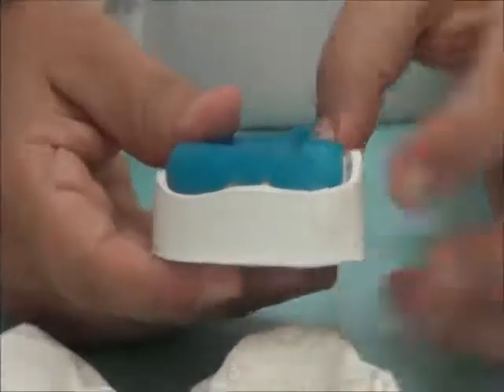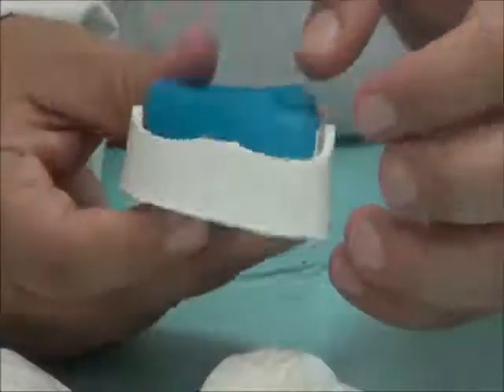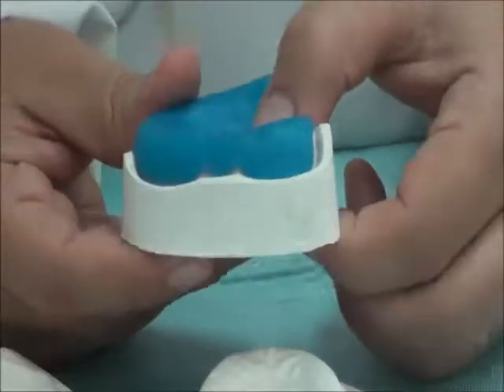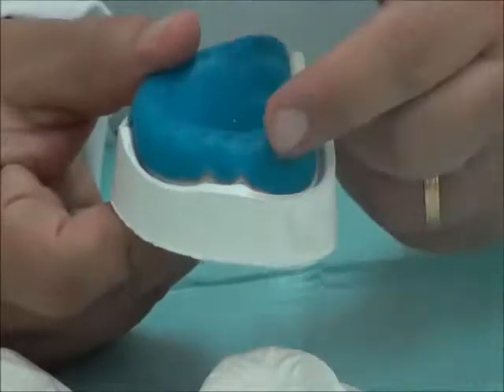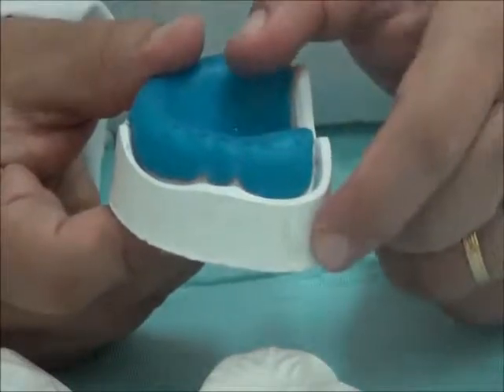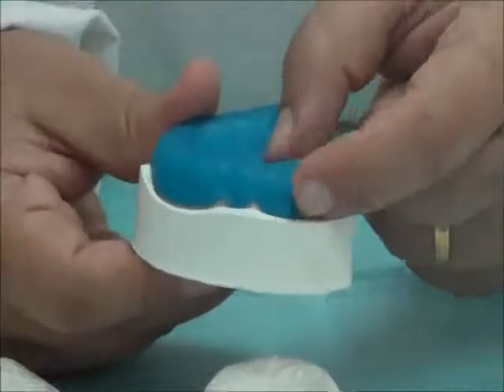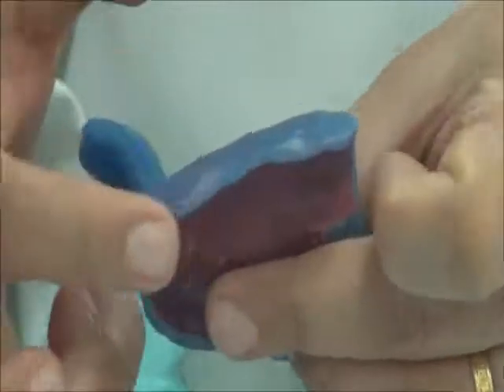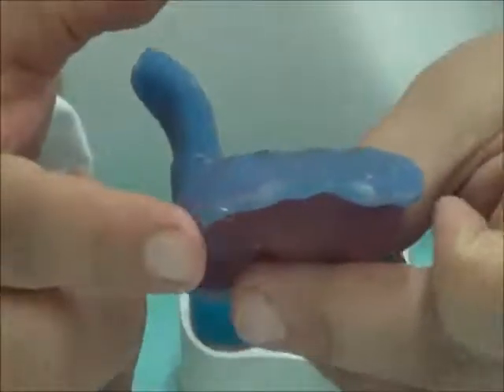So to perfect border molding, which is adding green stick to these borders, we need to make sure that we have space for the border molding material. How do we create space? By making our tray short from the sulcus. The tray is not in the full depth of the sulcus. The tray is short from the sulcus by around 2 to 3 millimeters. This allows a space for the green stick to be placed inside the mouth later on. So the outline of the tray will be away from the sulcus, and the border all around will be short from the sulcus by 2 millimeters.